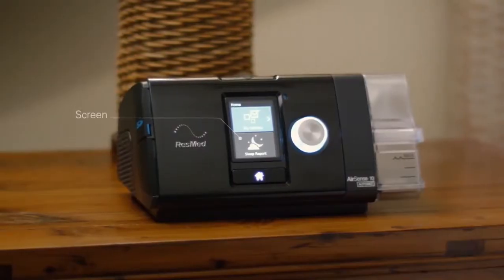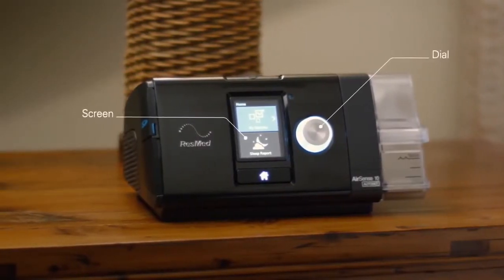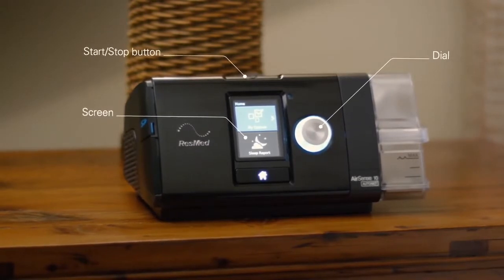The difference between the S9 and the Essence 10 has been dramatic for me. I wasn't brought up in the computer age, but my new machine is mechanically so easy to use.